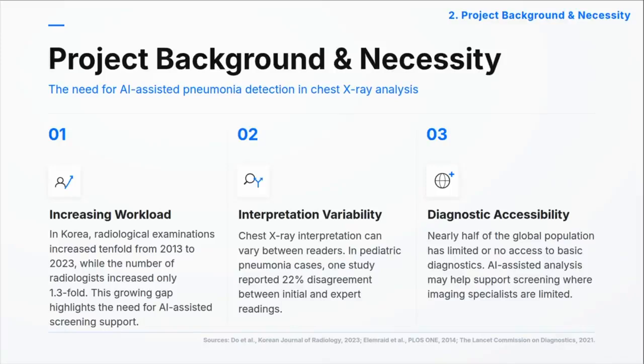Another issue is medical accessibility. In developing countries or regions with limited medical infrastructure, radiological interpretation itself may be difficult. Therefore, we focus on the potential of AI-assisted systems as medical screening tools.